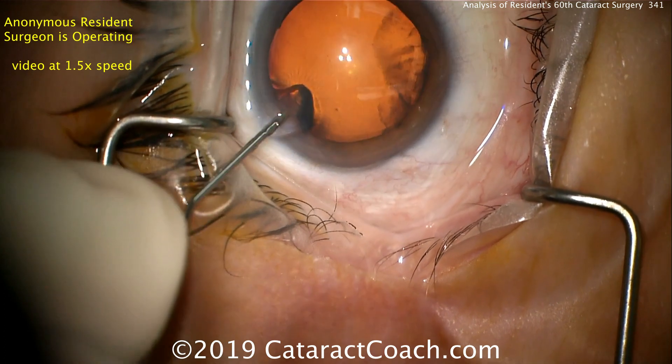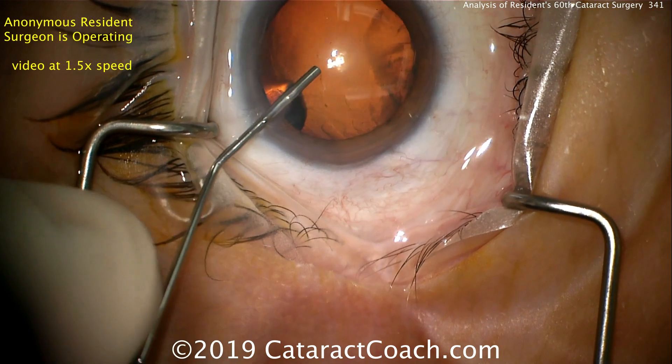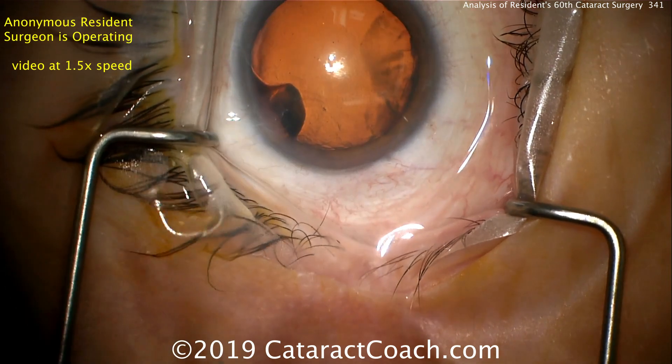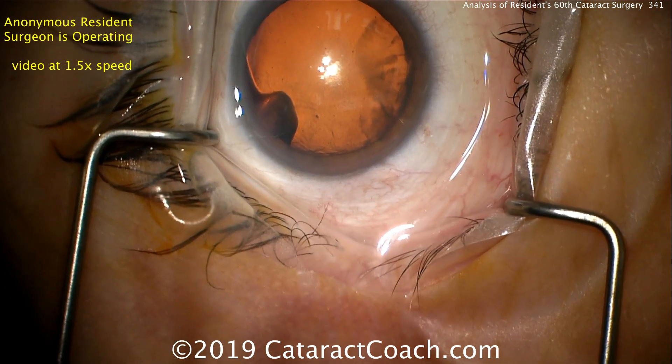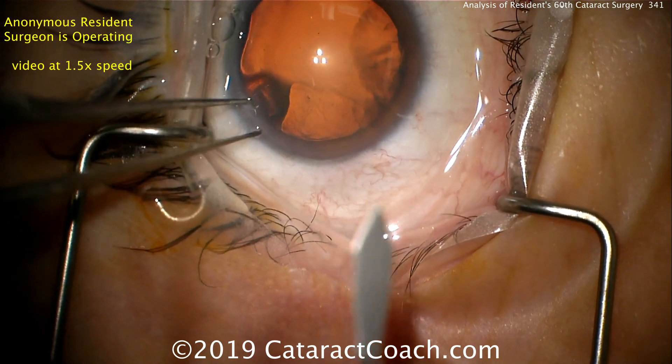We're starting off the case here. This is a paracentesis that's already been made, filling the anterior chamber with viscoelastic. I like that backfill — that's done well. The paracentesis looks like it's a little bit long, though, so the angle of that should be changed to be a little bit shorter.